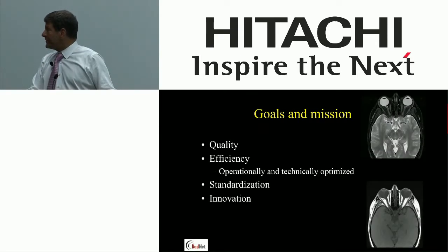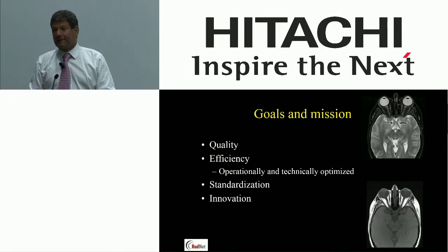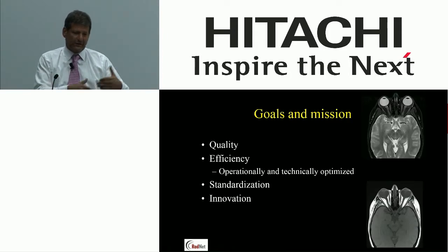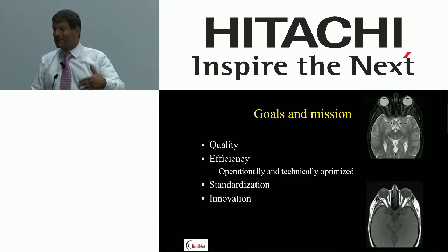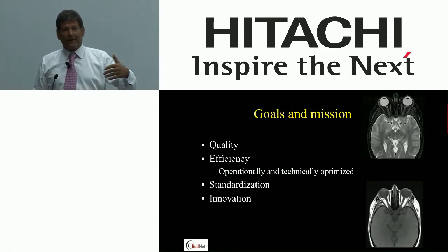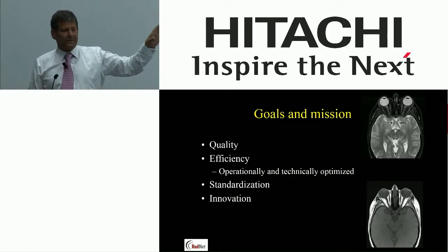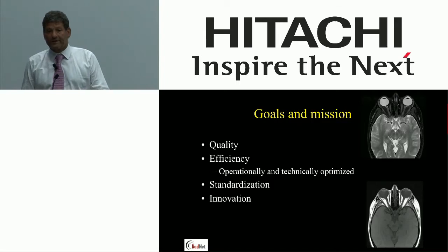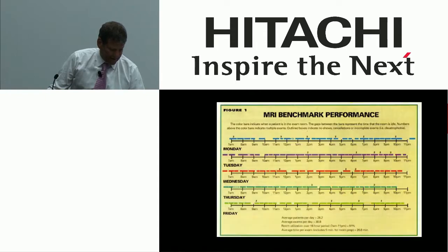So when it comes to efficiency, I think it's important to be operationally optimized. As you all know, there are a lot of sources of loss of efficiency in an exam, whether it's getting the patient to the on-deck position, getting the patient on and off the table, as well as looking at the way we scan. If I were to ask you in your facilities, who thinks that all of their MR sequences across their generations are optimally tuned, and there's no room left for improvement? Well, I certainly don't. I've been working on it for 2 years nonstop, so it's a difficult thing. So one of the things we're aiming at is some technical optimization.